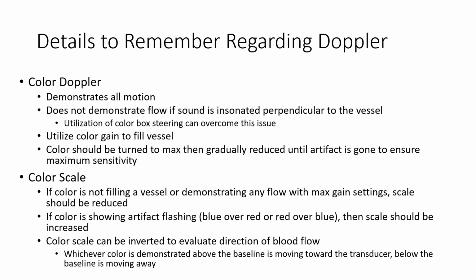Another good practice with color, if you want to have the most sensitive color possible, is to turn your color gain up as high as possible, and then you taper off on it until just all the artifact is gone and everything is real. If you just turn color on and assume it to be at maximum sensitivity, lots of times you can be missing data.